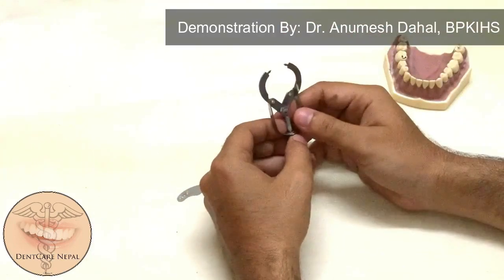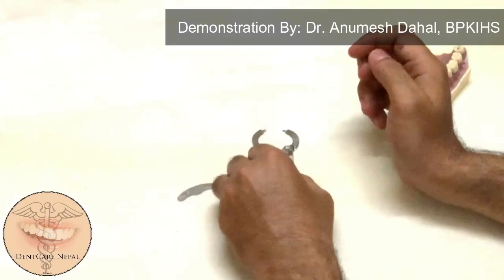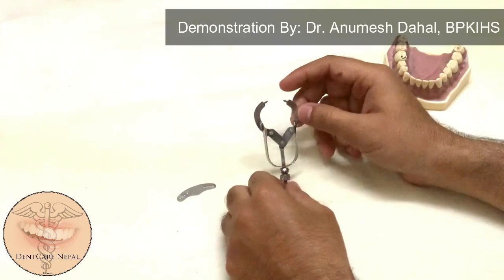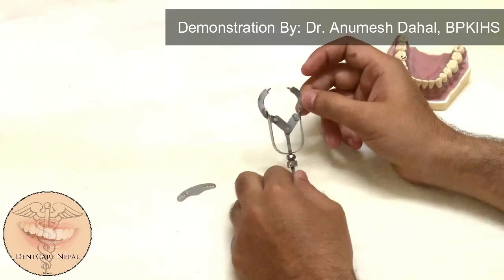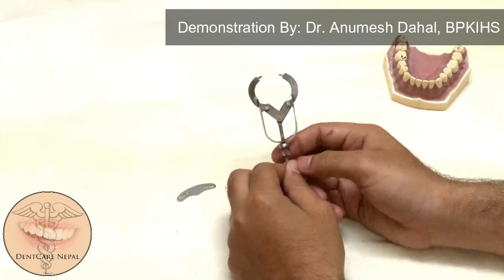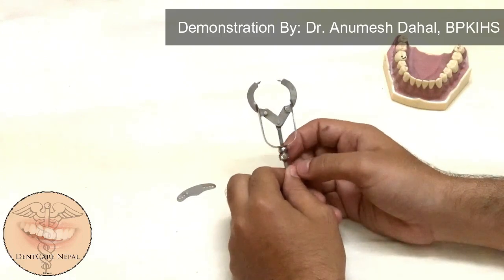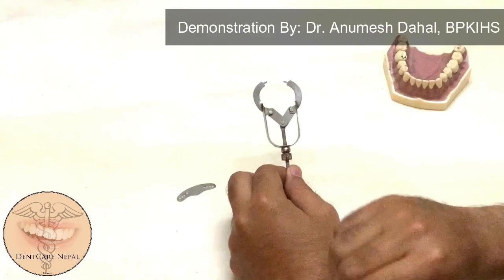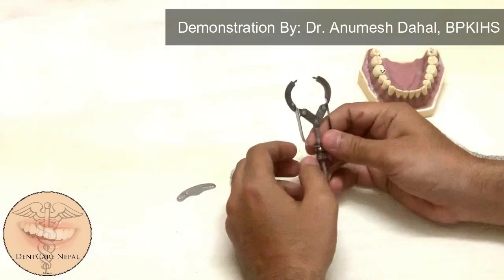Let me show you how this works visually. This is an ivory one type of matrix band retainer. Although this retainer has become old, the mechanism of how it works is good to know. It is not as complex as the Toffelmire retainer, which has two screws, and this one can be quite handy sometimes.